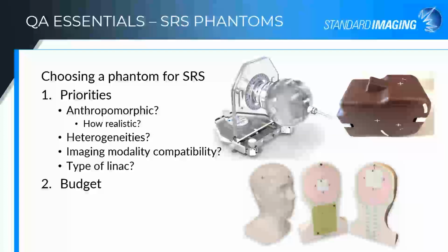Again, imaging modality compatibility. And you probably also really want to think about what type of linac am I using. So what I mean by that is, we have an MR visible phantom. So if you have a Unity or ViewRay, that might matter. CyberKnife might be something different.